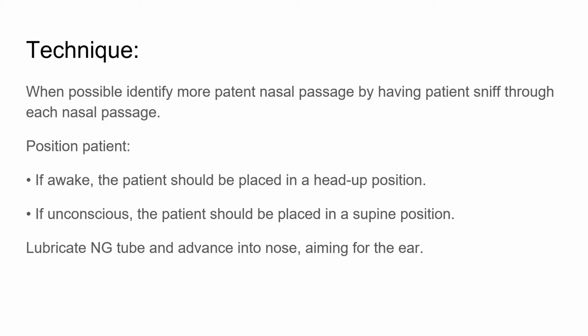So the technique: where possible, identify the more patent nasal passage by having the patient sniff through each nasal passage. If the patient is conscious and able to take commands, in such a condition the patient is asked to sniff through each nostril so that the patent nostril is identified. After the patent nostril is identified, the patient is made to lift his head up. If the patient is unconscious, in such a condition the patient is put in the supine position and the nasogastric tube is inserted.